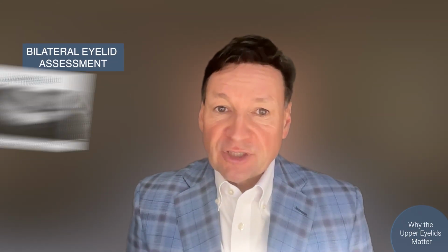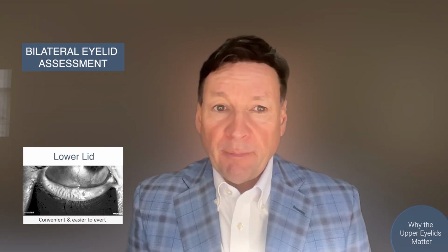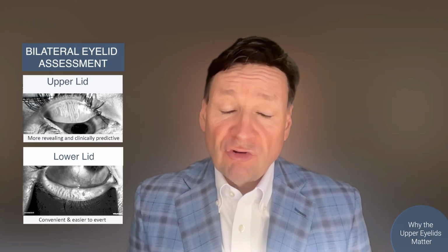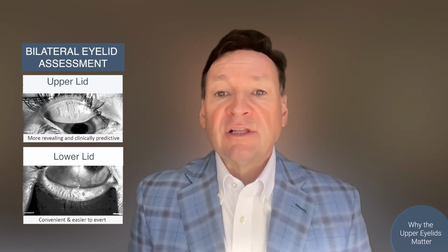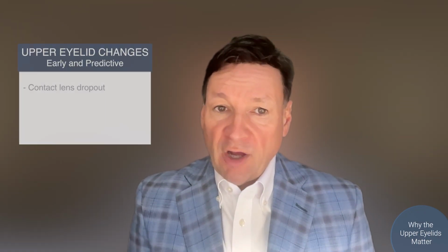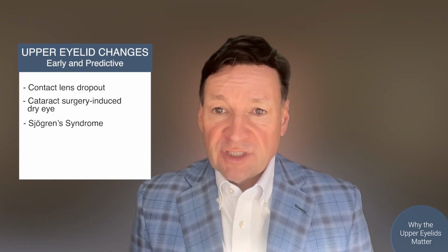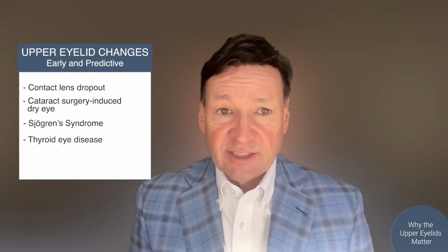We routinely image the lower lid because it is convenient and easier to evert, but the upper eyelid frequently reveals earlier, more severe, and more clinically predictive changes across a range of conditions, from contact lens dropout to cataract surgery-induced dry eye, Sjogren's syndrome, and even thyroid eye disease.